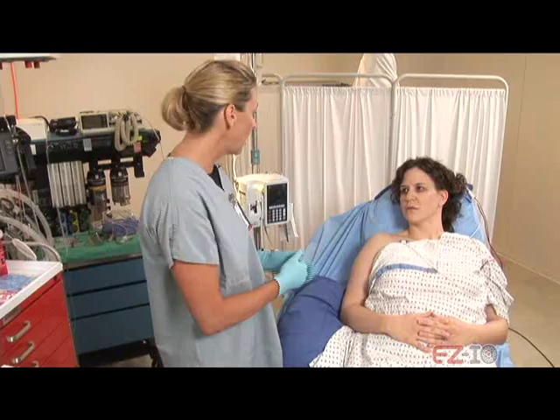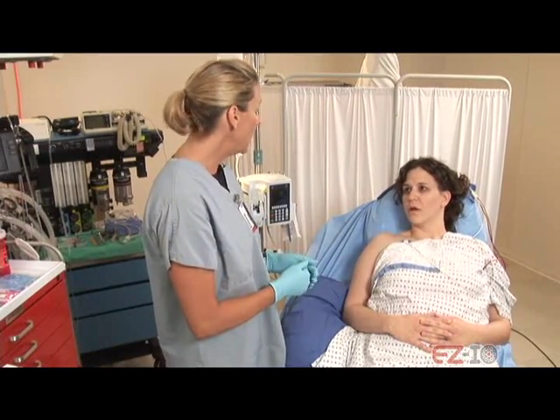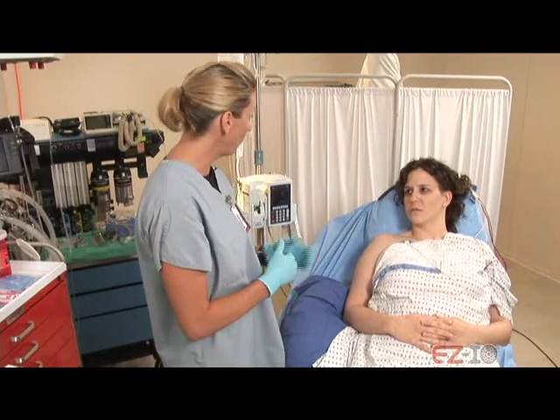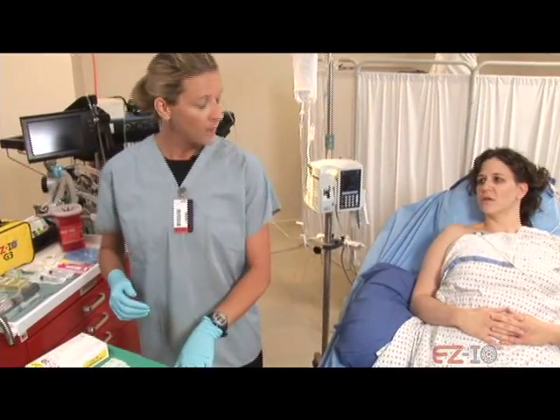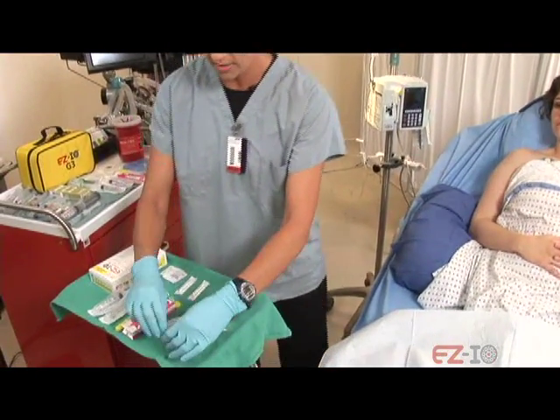Okay Karen, we were not able to get IV access, so what we're going to do is get vascular access by putting it into the bone. You're going to feel a little bit of pressure when it's going into the bone, and then I'm going to give you some medication once it's in that's going to help numb that area up so you won't feel anything after that. Are you allergic to any medications? Just penicillin. Have you ever had lidocaine before? I'm not sure.